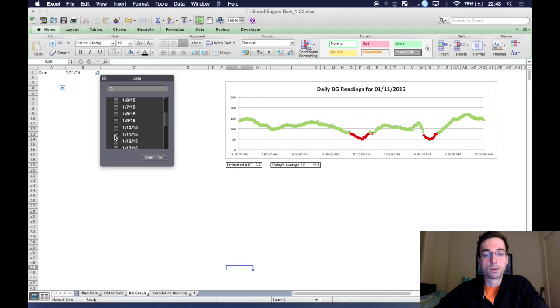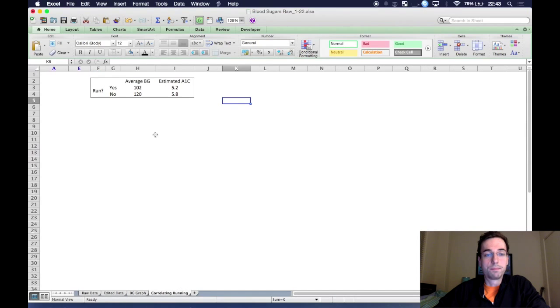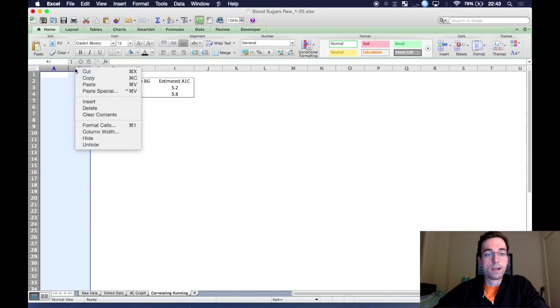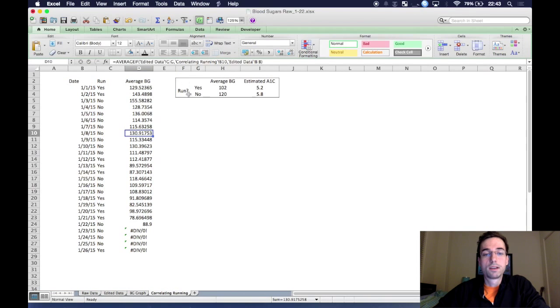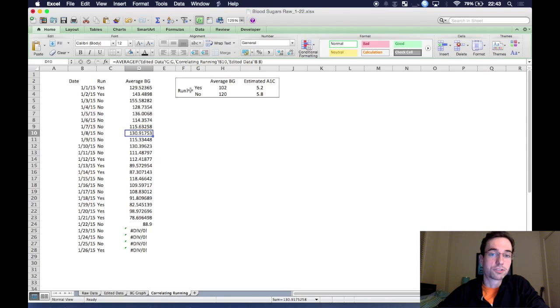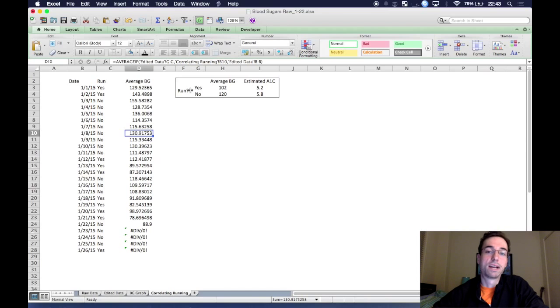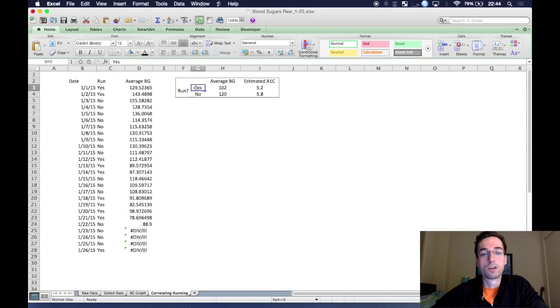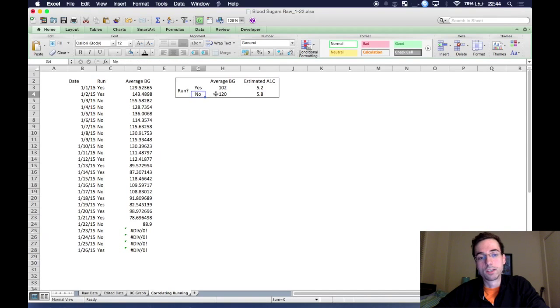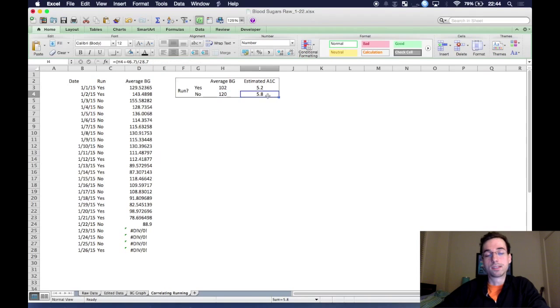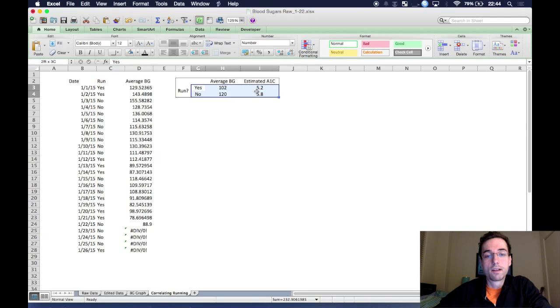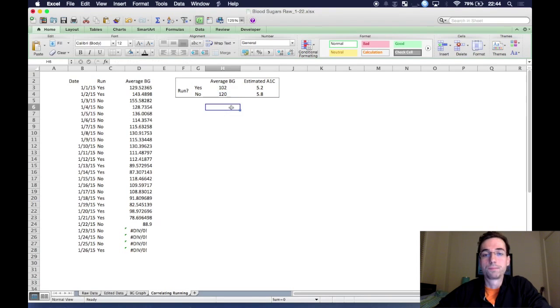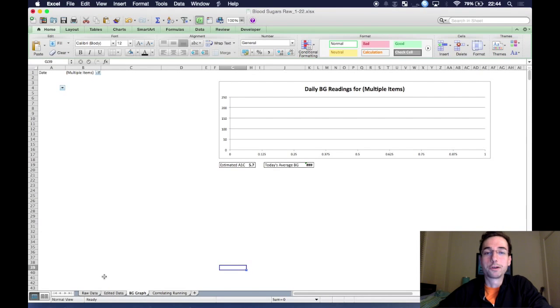And then the other thing that I created that might be of interest is a way for you to see, to understand if your blood sugar is varying by whether or not you exercise or maybe you can do it by whether or not you ate a certain food or had breakfast in the morning or any sort of binary yes-no for the day. So for me, I chose on the days when I run, what is my average blood sugar and what would that correlate to an estimated A1C? And for the days that I don't run, what is my average blood sugar and what would that A1C look like? So as you can see, for me, it looks like when I run, my blood sugar is about 20 points lower than when I don't run on average throughout the day. So I think these sort of experiments are pretty interesting and you have all the data at your fingertips. So I just wanted to show you quickly how I do that.